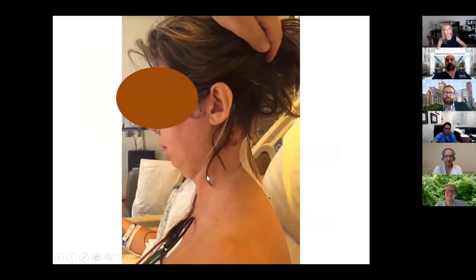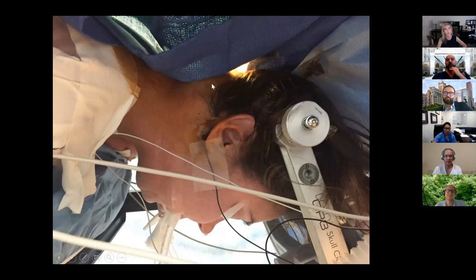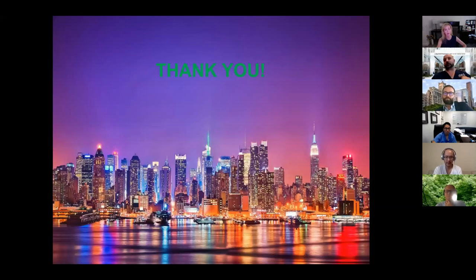And this was the patient, again, transferred in from somewhere else. This is the patient post-fusion, and you can see the fold here. You can actually look at it better here. You see that neck fold? So when I do an OC fusion, I want to make sure there are no neck folds. That patient has to be extended. So we took out the plate. She was extended to get rid of that fold to have a more anatomic and more horizontal gaze. So be careful when you do those OC fusions.